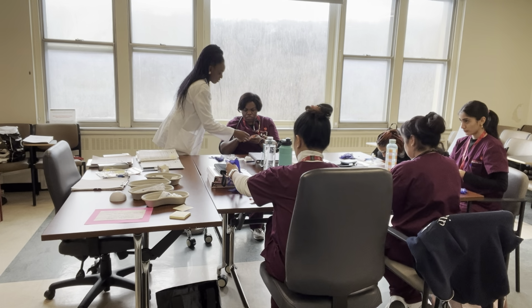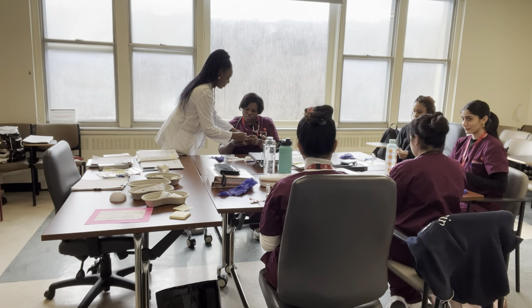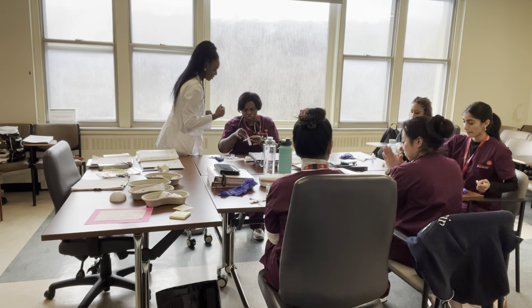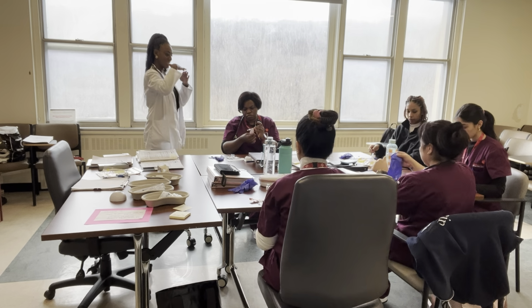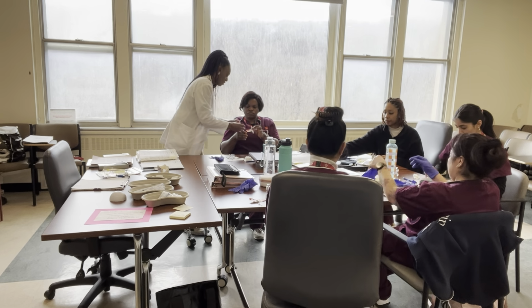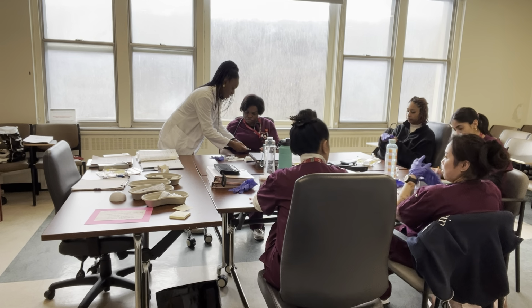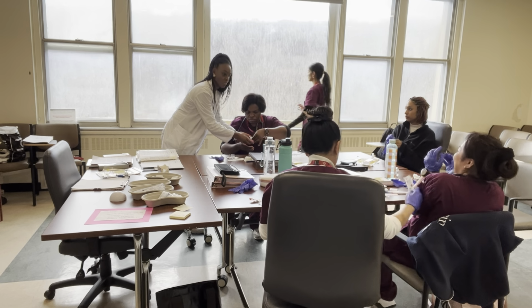There's two ways of doing it. Yeah, you can do it like that, but it's probably not gonna stick, so maybe you pull out the whole thing. If you like putting it in the middle, just pull out the whole thing, all the way. Yeah, I have another one. Just take care of your finger first, and then afterwards you can do it. You'll probably wear gloves. So your needle's really bent. See, it's completely at a 90-degree angle. Okay? That's okay. So we can always fix this. When you do this, you can adjust. There you go. Then you can put it in half.